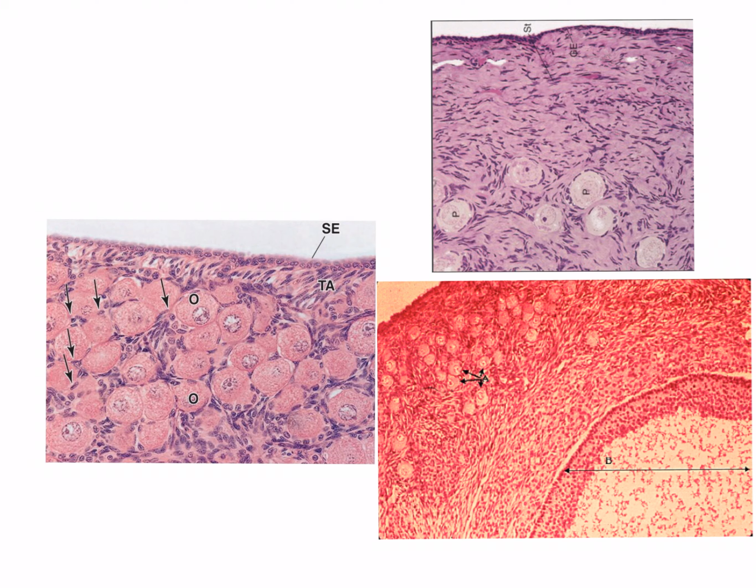The way that I've figured that out is that we've got lots of these ovarian follicles all around the top layer of the section. As we're circling here, here, and here, all of these are individual ovarian follicles. They're not very developed at all. They're within the earlier stages, so they're called primordial follicles, but that's beyond what you need to know for the scope of this semester.